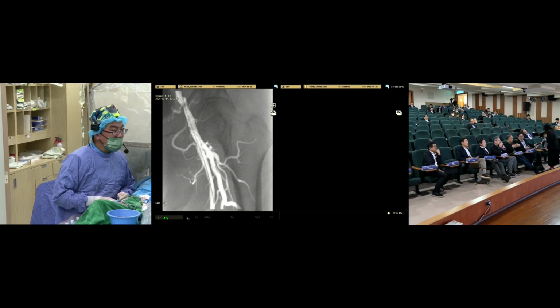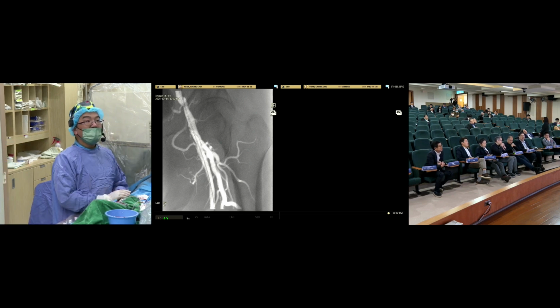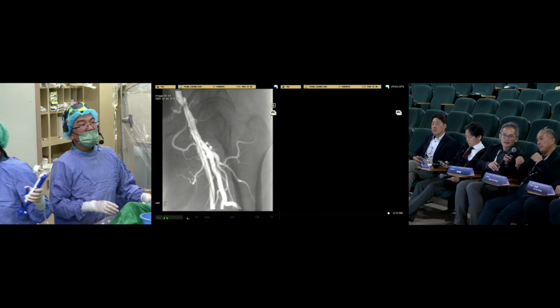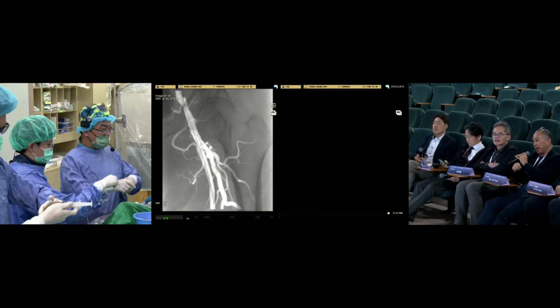So maybe I need to deploy it on the down pulse. And Professor Tan suggests, can you move the C-arm to 45 degrees? I think you should put the C-arm a bit more lateral to open up the profunda origin, basically, to have a good look at it and magnify it up even more.